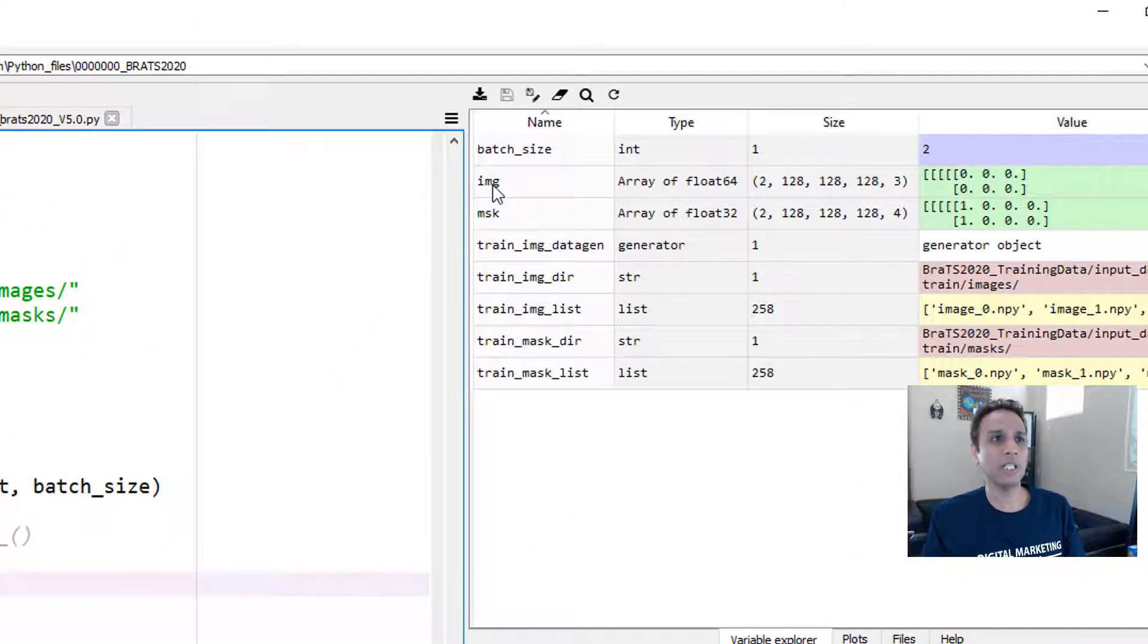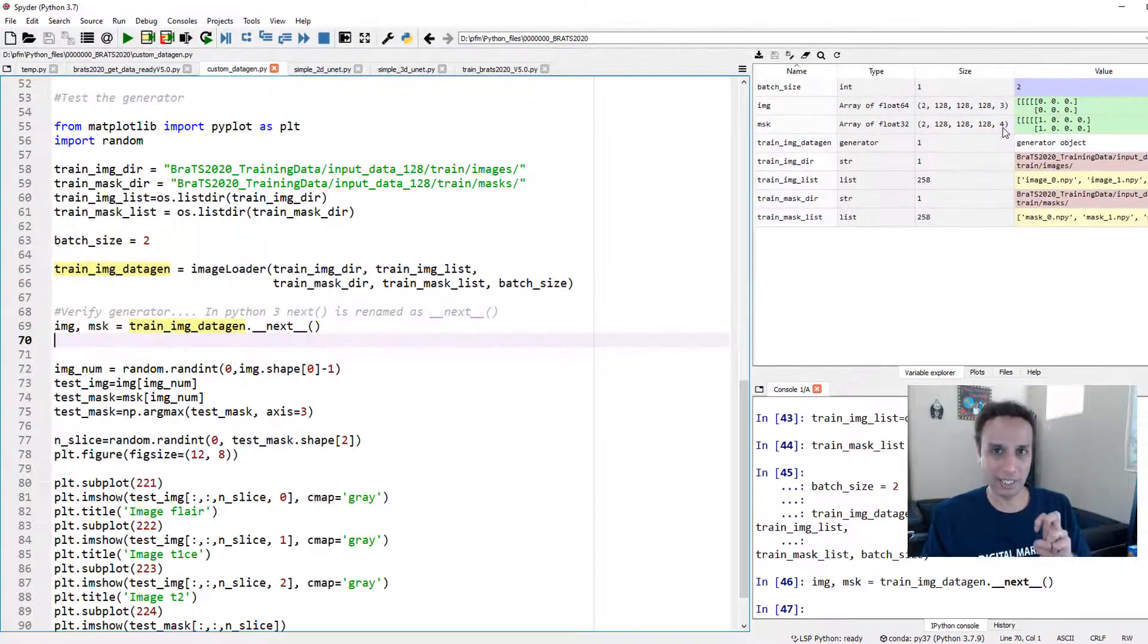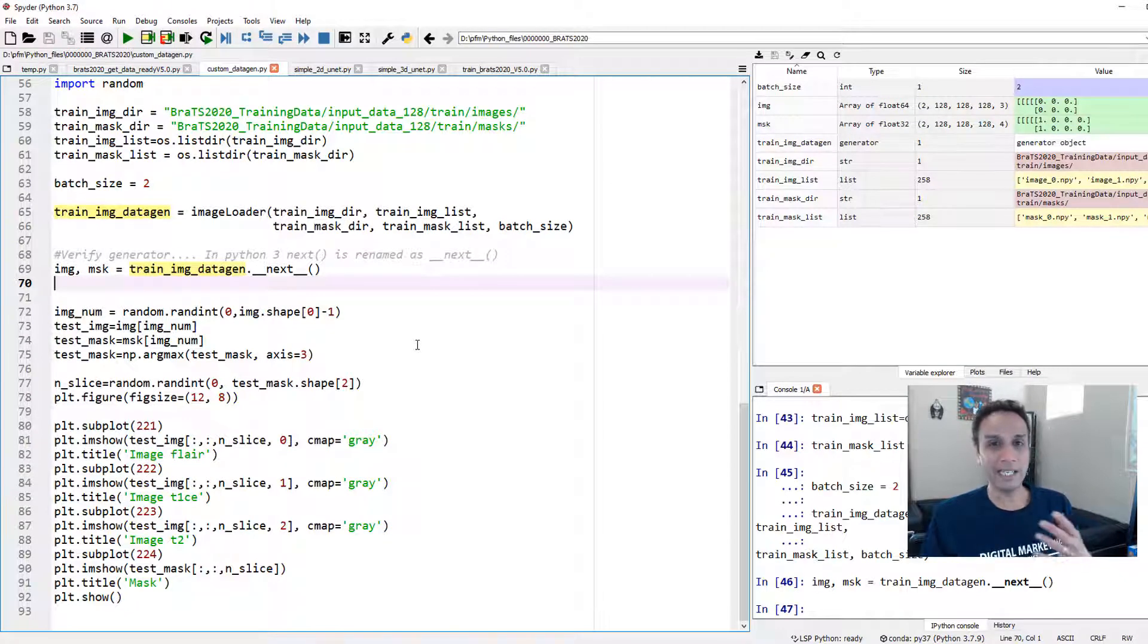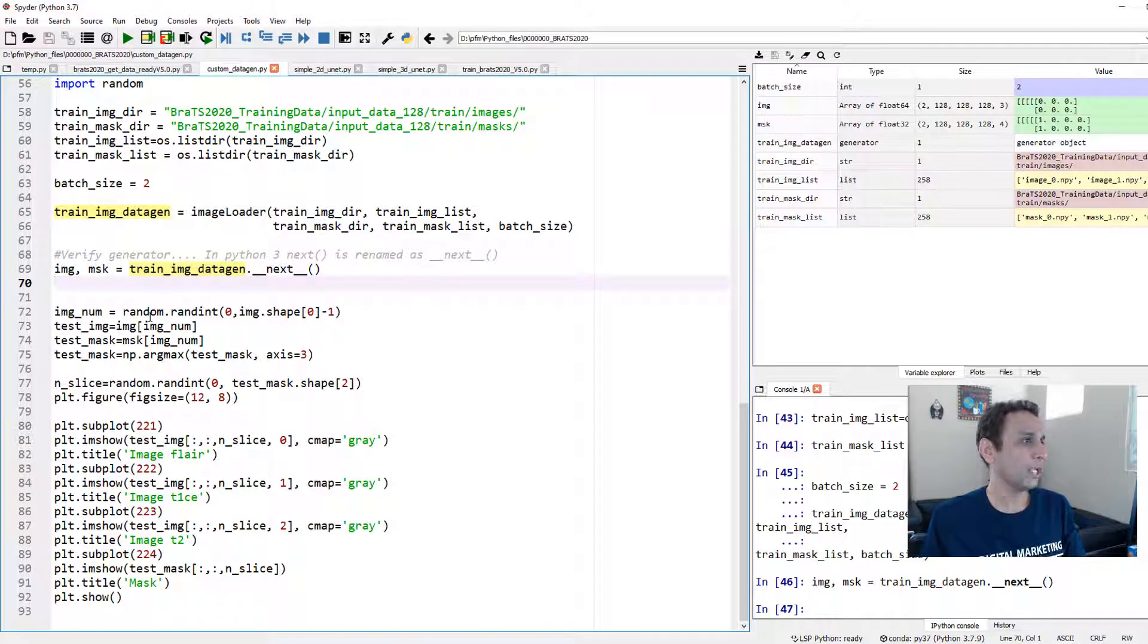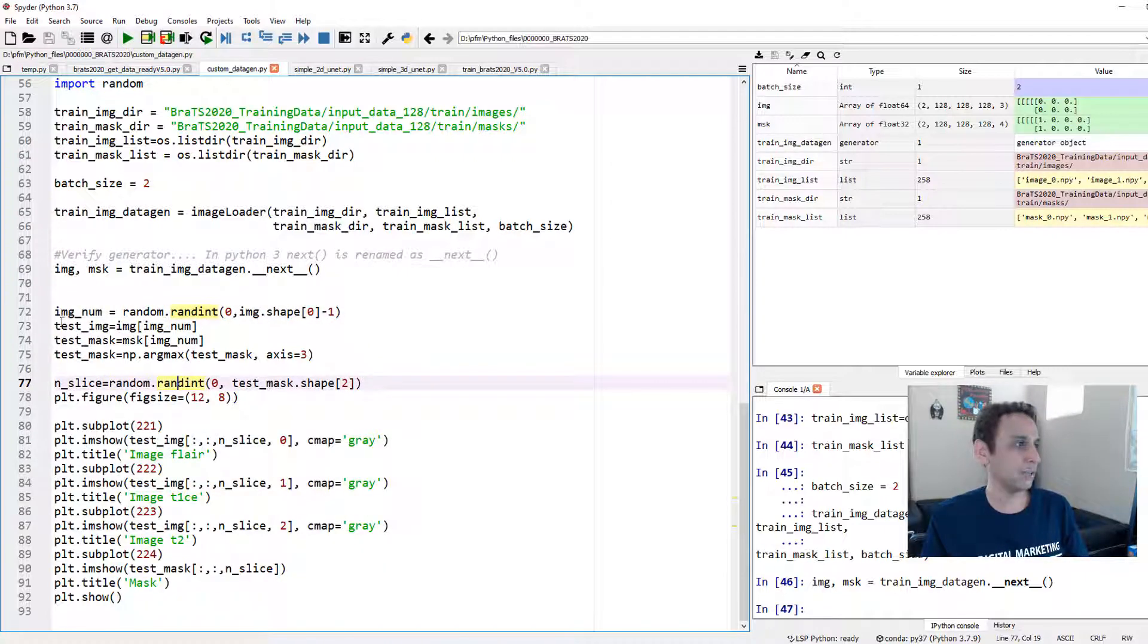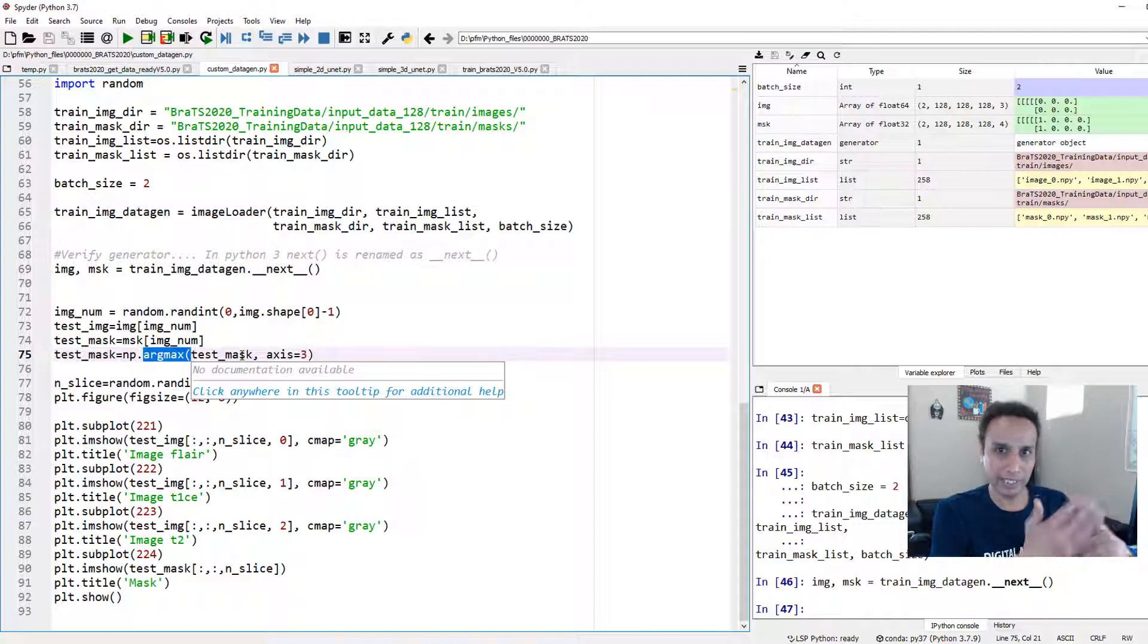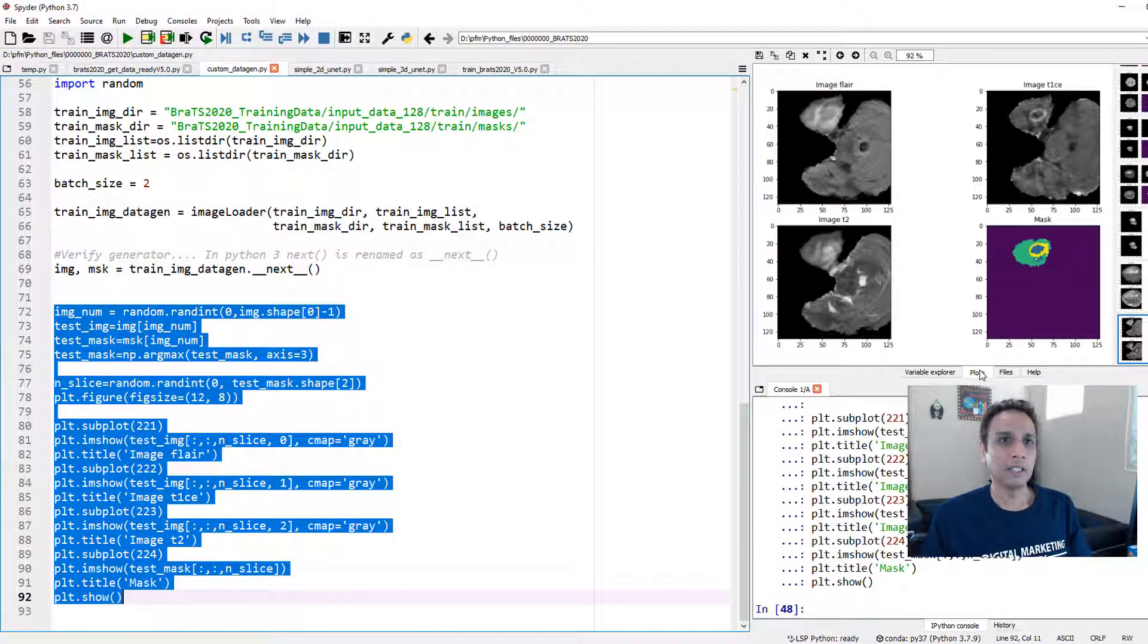Now I should get a batch of images and batch of masks. If I come up here, you see, I get two images, 128 by 128 by 128 by three, three represents three channels, and two masks, 128 by 128 by 128 by four, four represents these four categorical channels, each for each of these channels. So again, a sanity check, let's go ahead and plot it, and make sure there is indeed a good match, that things are not messed up. So I'm going to randomly select an image number and randomly select a slice in each of these images, and then plot it. I'm applying argmax to convert my categorical into an integer encoded, so I can plot it and have a quick look at it.